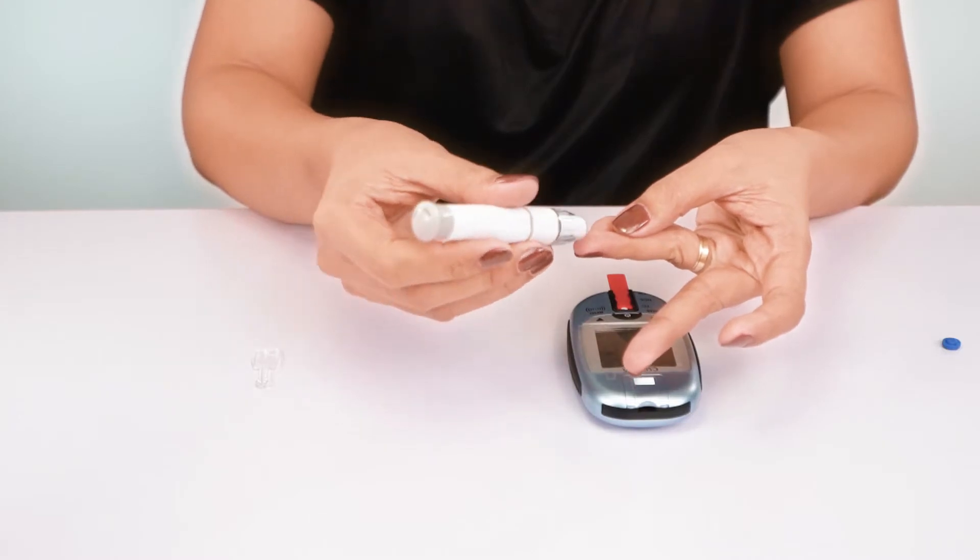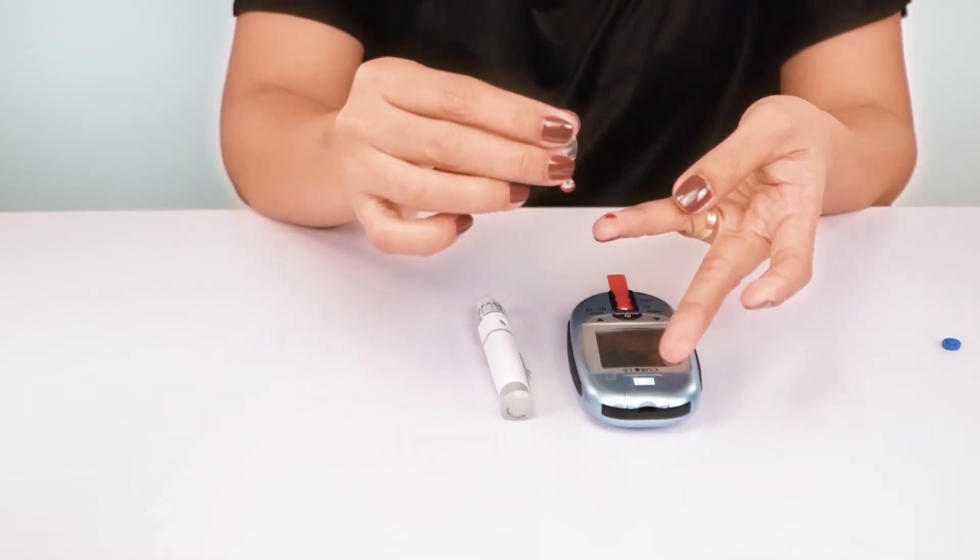It's user-friendly. It strips blood sample through capillary action for an easy fill.